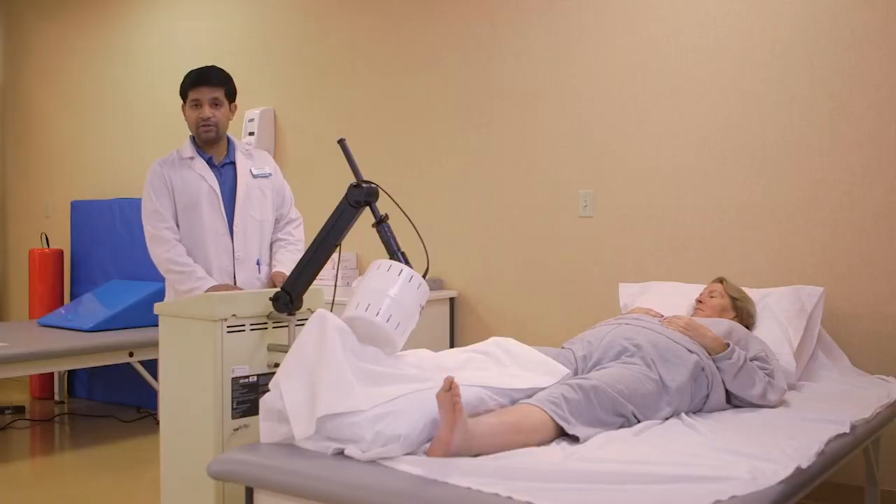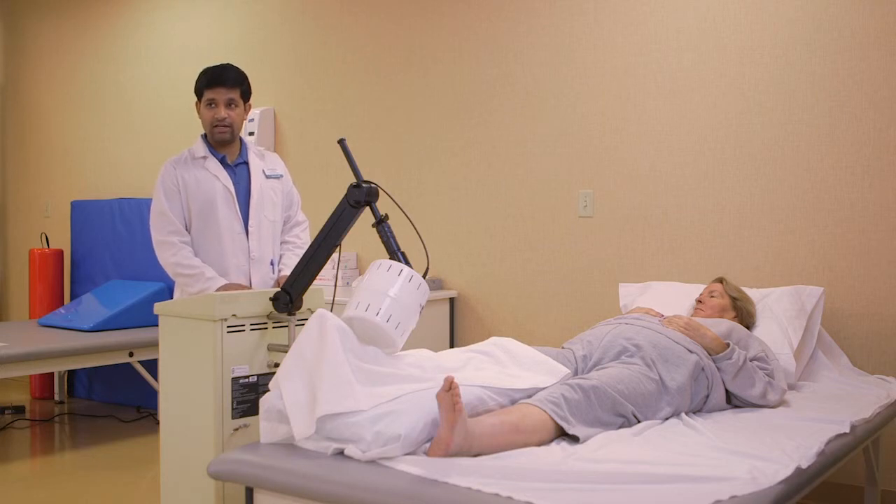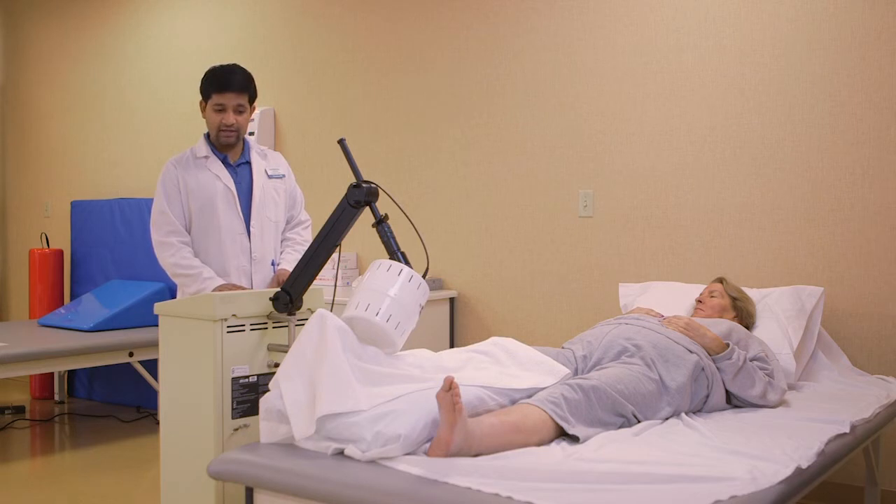Usually we do this treatment for 15 to 20 minutes, and we can do it in conjunction with any other modalities and treatments. We use this modality for making recovery time faster so the patient can go home faster.